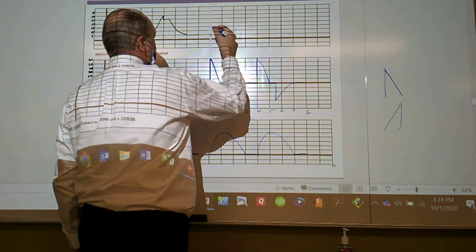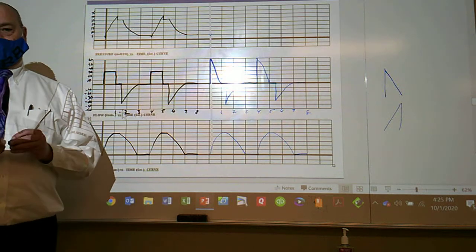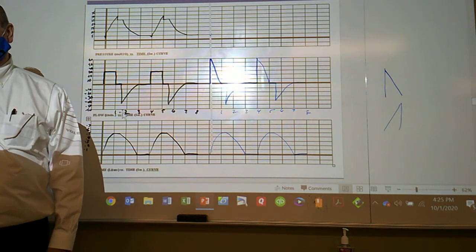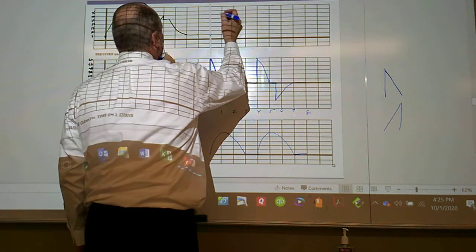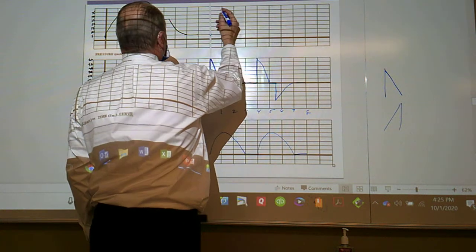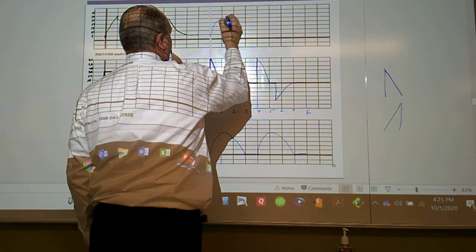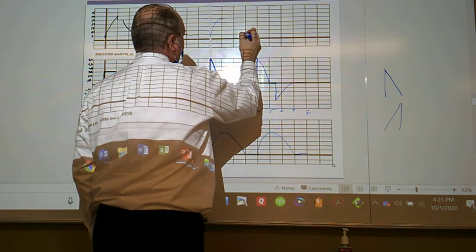So here I have patient trigger. And what kind of a pressure curve does a decelerating ramp cause? Shark tooth, shark fin. I don't even know what it's called. Okay, so my peak pressure is 25, my baseline's 5, and then I have a pause, and then I'm going to come back to my baseline like that.